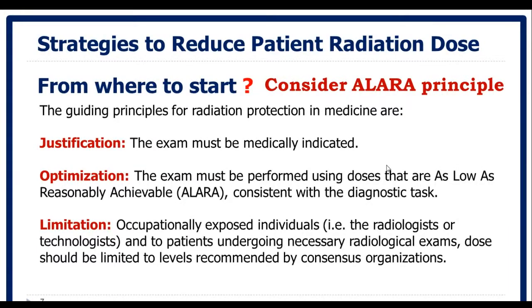And also this should be followed by reviewing the scanning protocols in terms of the purpose of the exam and patient size, for example, giving attention to any pediatric protocols, because pediatrics are more sensitive to ionizing radiation compared to elderlies, as Prof mentioned. So gathering this together will be the initial step for optimizing the practice.